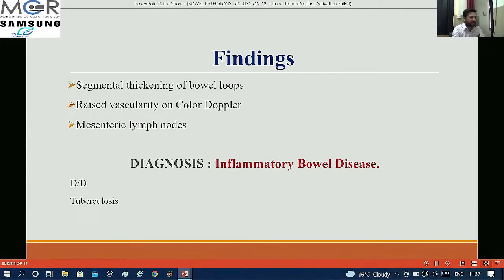So my findings are segmental thickening of bowel loops, raised vascularity on color Doppler, and mesenteric lymph nodes. Based on these findings my diagnosis was inflammatory bowel disease. Its closest differential is tuberculosis.